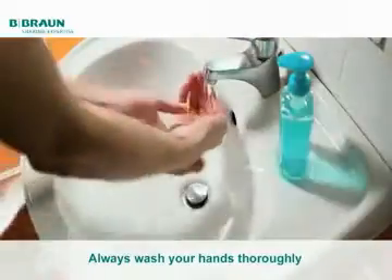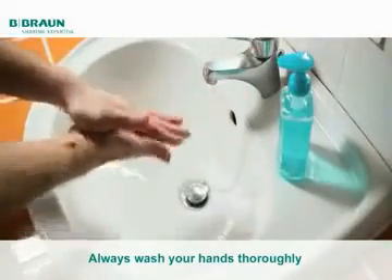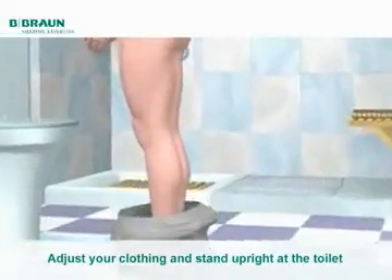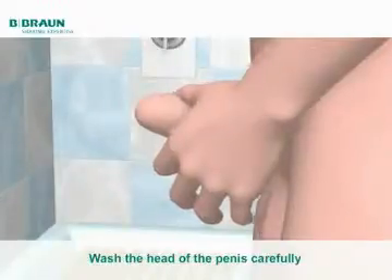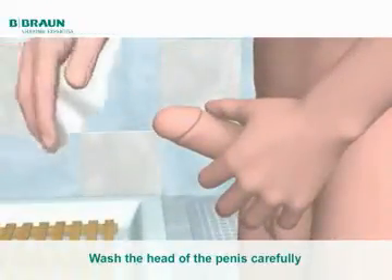Prior to starting the catheterisation, always wash your hands thoroughly. Adjust your clothing as necessary and stand upright at the toilet, although you can sit down if this is easier for you. Always try to urinate first before using a catheter if you feel you can do so. Pull the foreskin back and wash the head of the penis carefully.